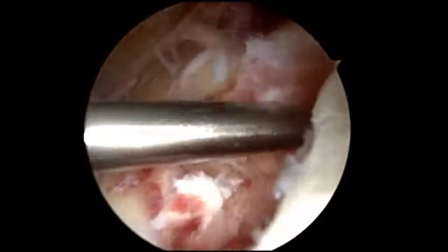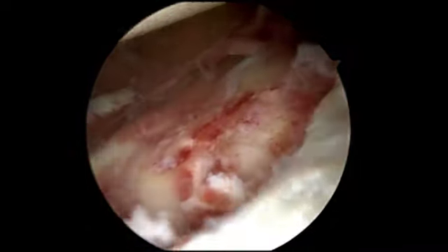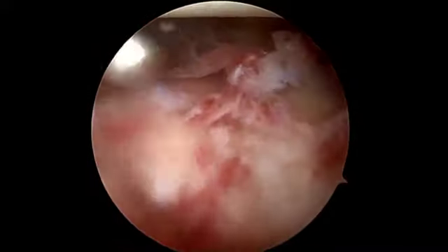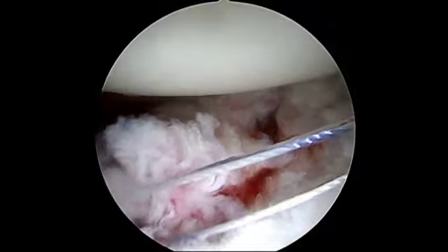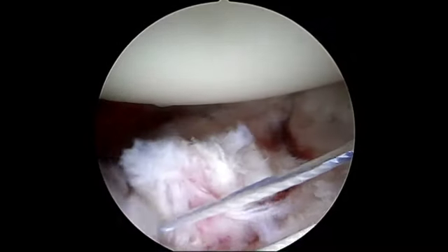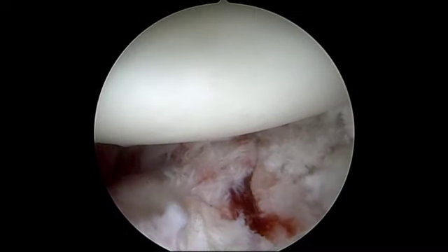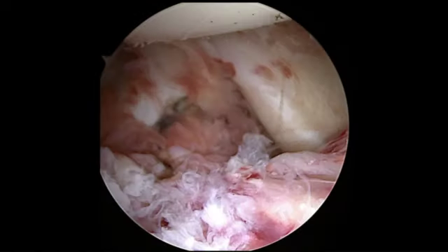Arthroscopic evaluation began with a standard posterior portal. An elevator is used to initiate debridement of the fracture. The fracture was further debrided using electrocautery while viewing from the anterior superior portal. A small loose body was also removed. After extensive mobilization, a traction suture was placed through a posterior portal exit in order to aid in reduction. Cartilage defect was noted, and minor bone loss was noted in the fracture bed as a result of the comminution.